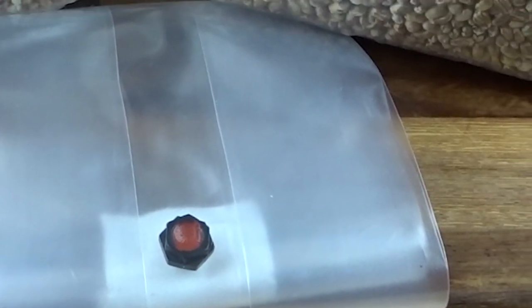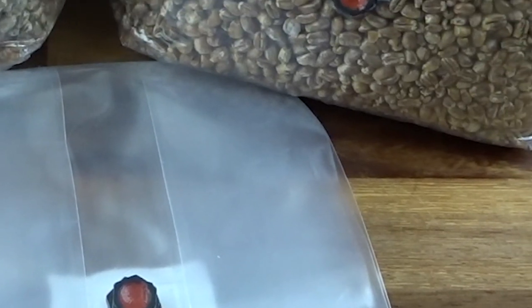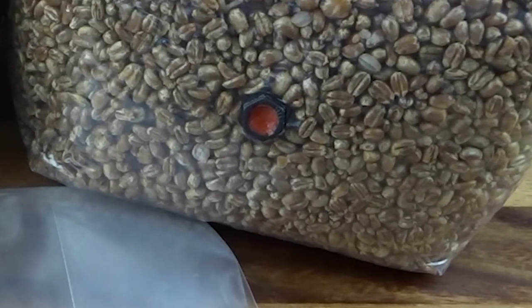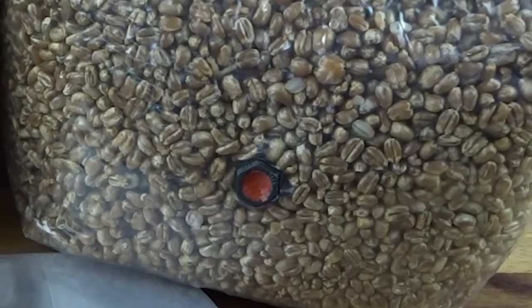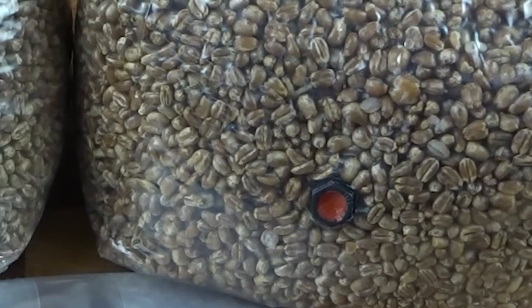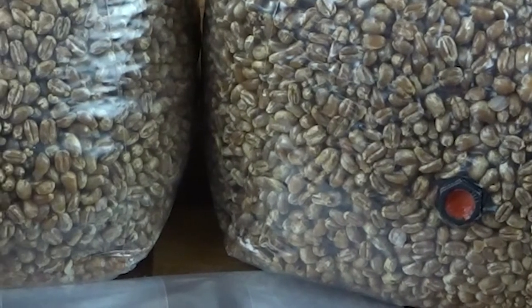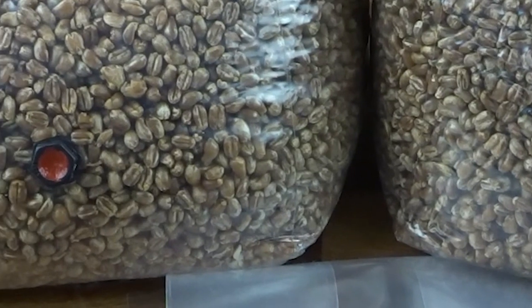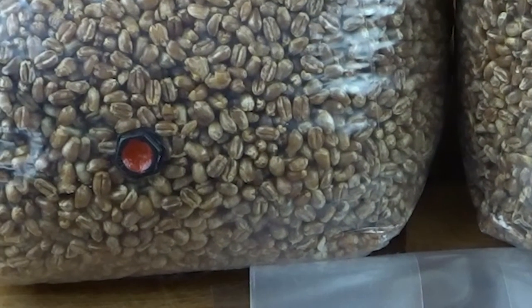You now have a solid, reusable, autoclave safe bag injection port. You won't need to wait 24 hours each time you want to use one of these bags, nor do you have to worry about knocking this port off. Simply hold the injection port, inject through it and go about your business. Once you're finished with the bag, simply unscrew the injection port and repeat the process with a new bag.